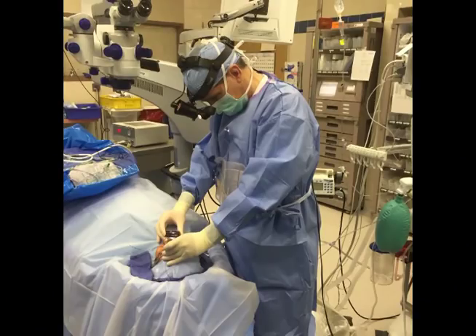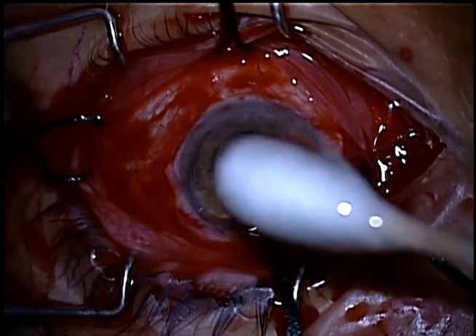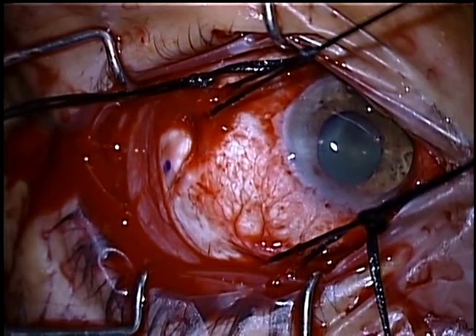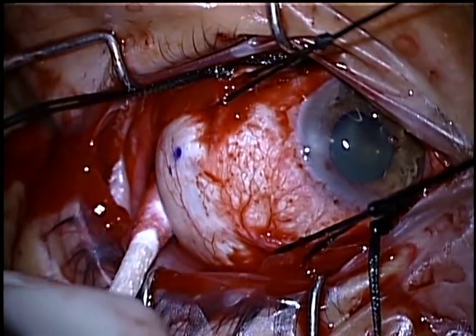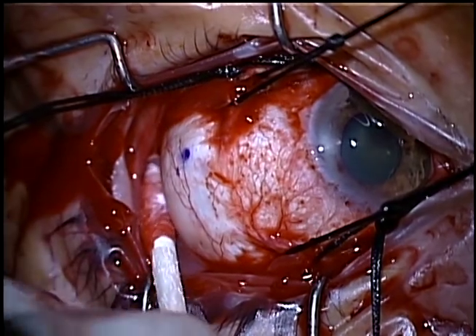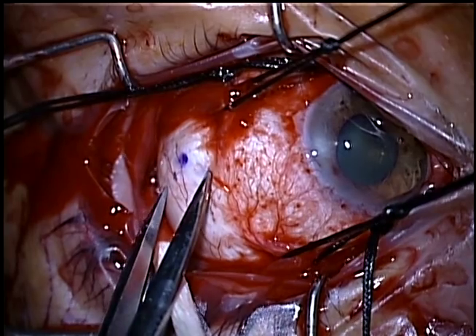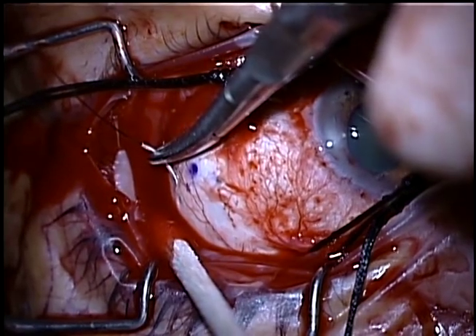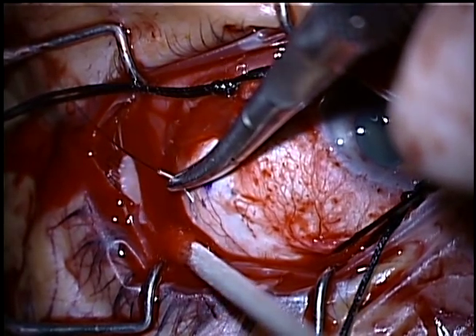At this point, indirect ophthalmoscopy is performed. Cryopexy is used to seal the retinal tears down and mark the sclera where the belt will be placed. Here you see a blue mark on the sclera. That's where the retinal tear is located internally. Using calipers, we mark the sclera where we want to place a mattress suture. These sutures will hold in place the scleral band.